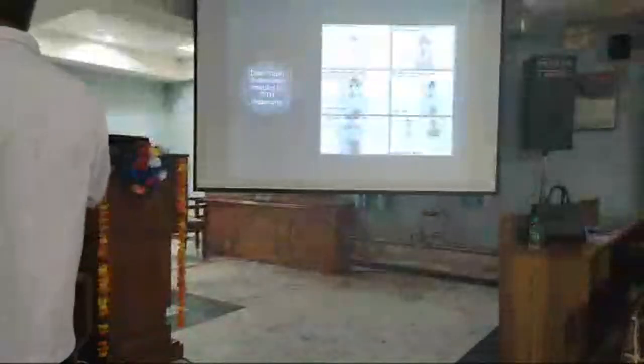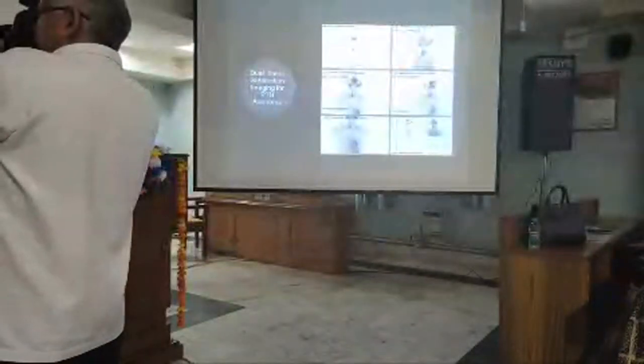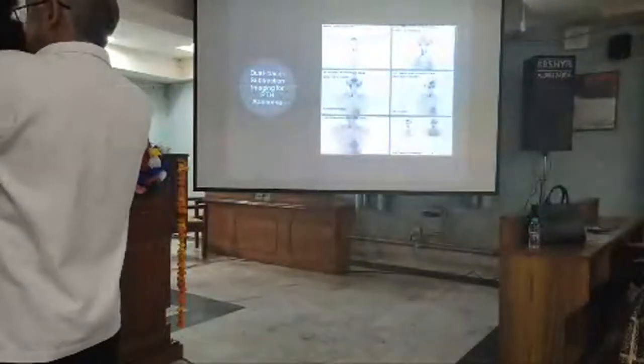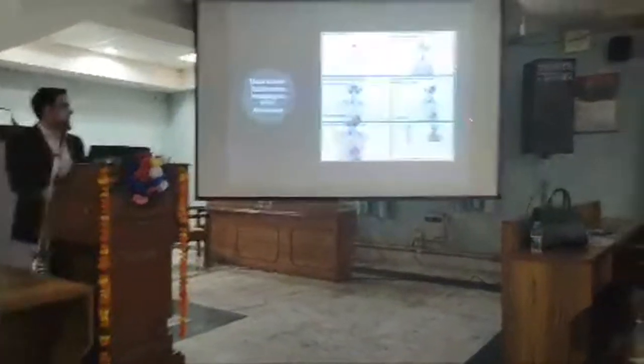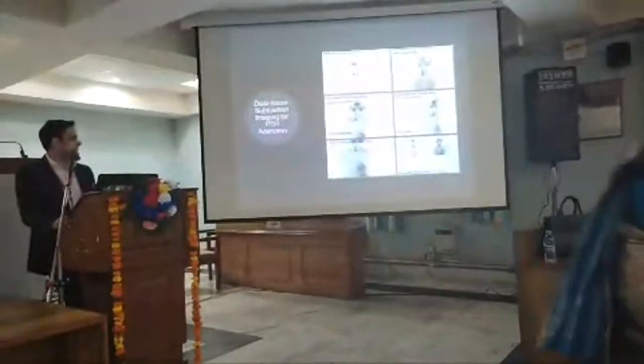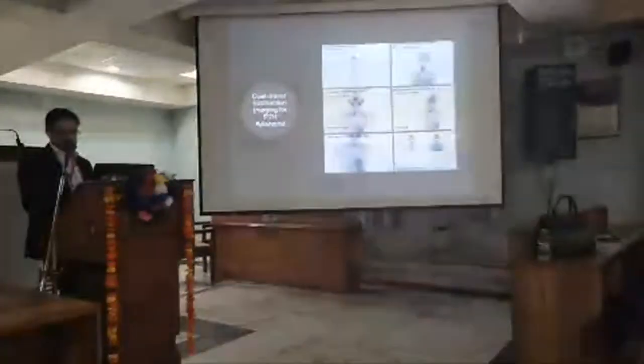Radionuclide one is technetium-99m, which is used for the thyroid scan, and the second injection is of the sestamibi. We acquire different static images and then subtract one image from the other, and the result is the exact localization of the parathyroid adenoma.